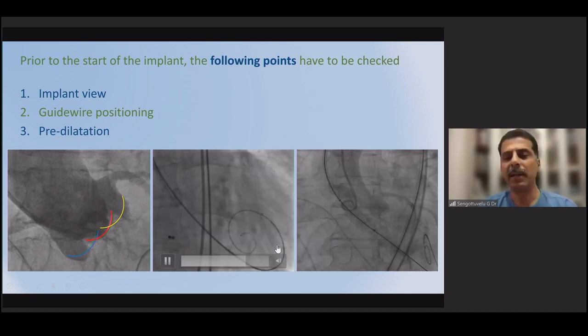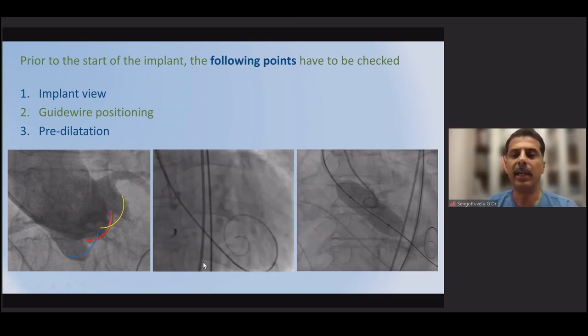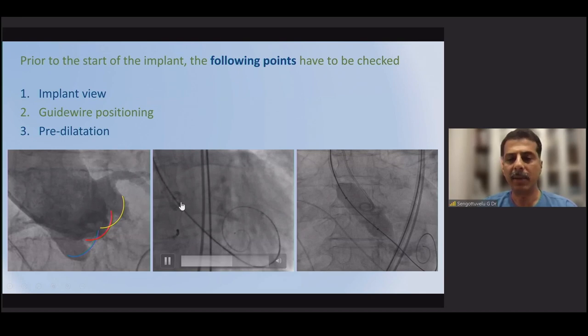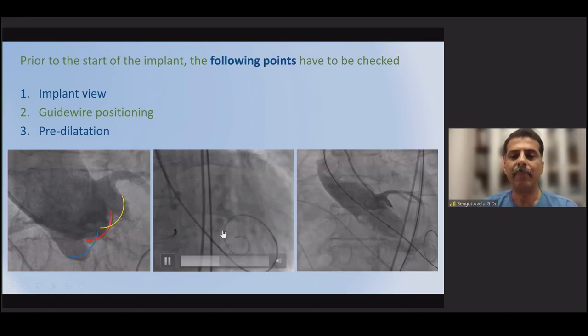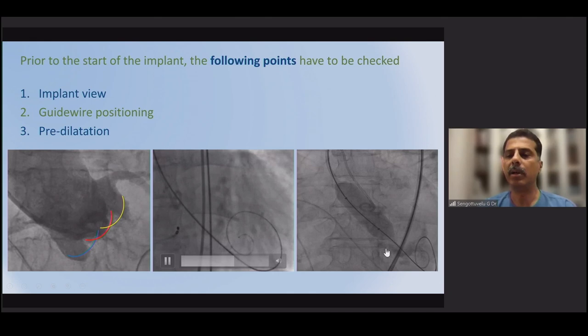An important step is wire placement. The curvature should face upward, but crucially the wire coil must be in the mid-cavity. If placed at the apex, the wire may push the valve upward. If placed too close to the LVOT, when the stent frame opens and comes down during deployment, there is a risk of valve pop-out. It is essential to keep the wire in the middle of the cavity.